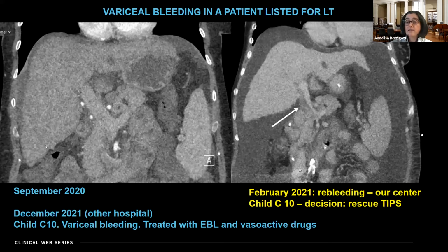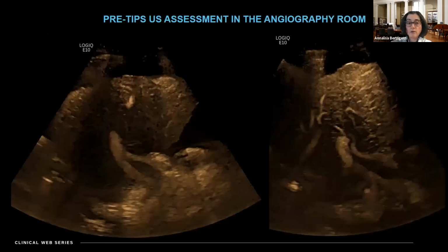She came to us, and in February 2021 had a second episode of bleeding. She was very sick, and we could identify on CT a partial portal vein thrombosis, as you see indicated by the arrow, and the decision was immediately to try to put a rescue TIPS in to try to keep the patient on the safe side for allowing a transplantation later on. And these are the images which I took during the TIPS positioning.